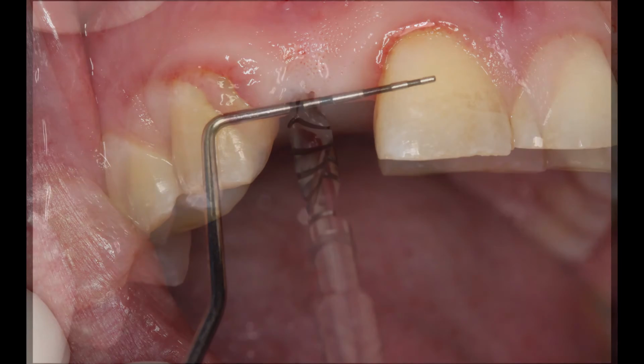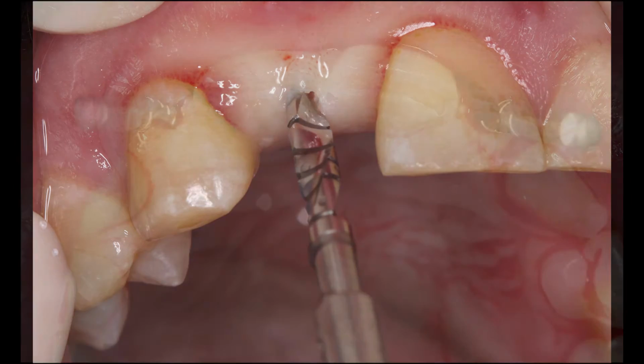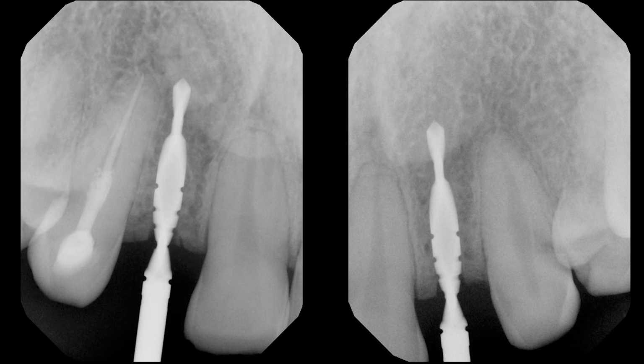To create proper emergent profiles for the implant retained crowns in the maxillary right and left lateral incisor positions, the 2 millimeter pilot drill was centered between the teeth adjacent to the edentulous sites. The osteotomies were positioned approximately 3 millimeters palatal to the facial aspect of the adjacent dentition to allow for the best aesthetics and enough facial room for a custom abutment and implant retained crown. The mesial distal angulation of the drill was checked with a digital periapical radiograph.